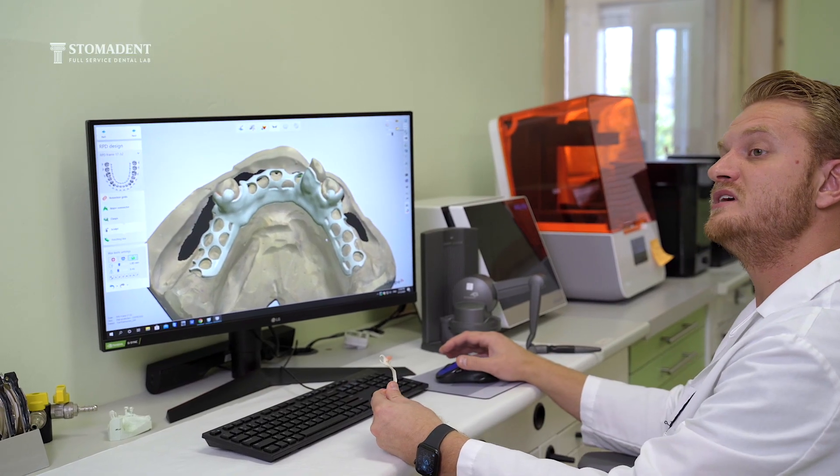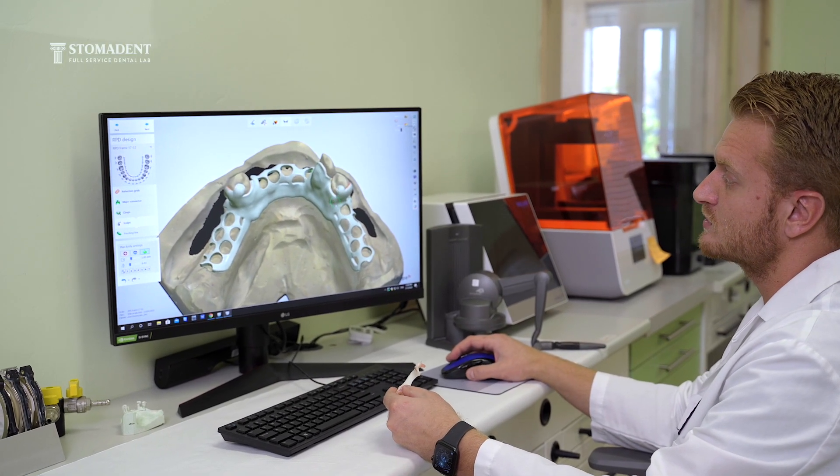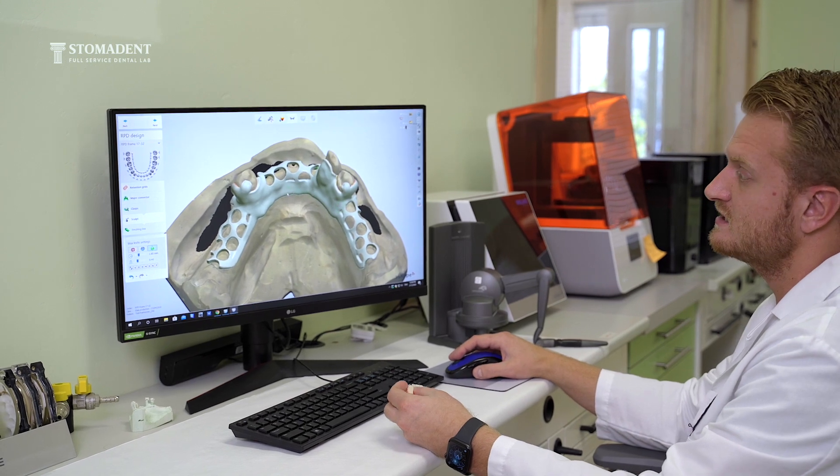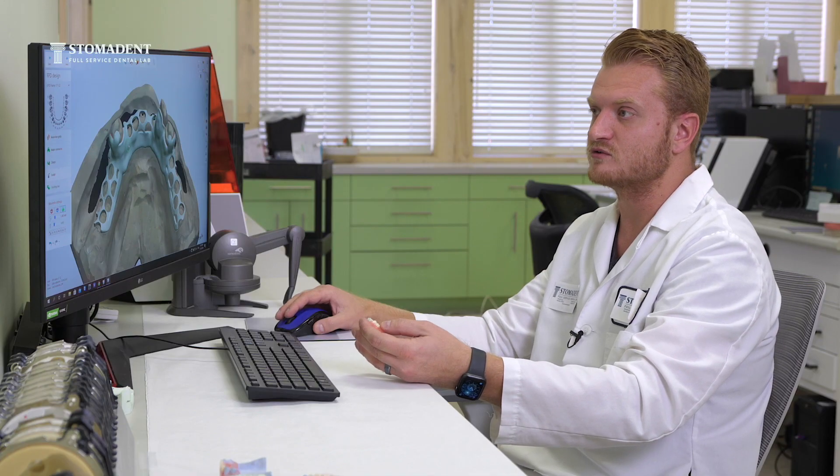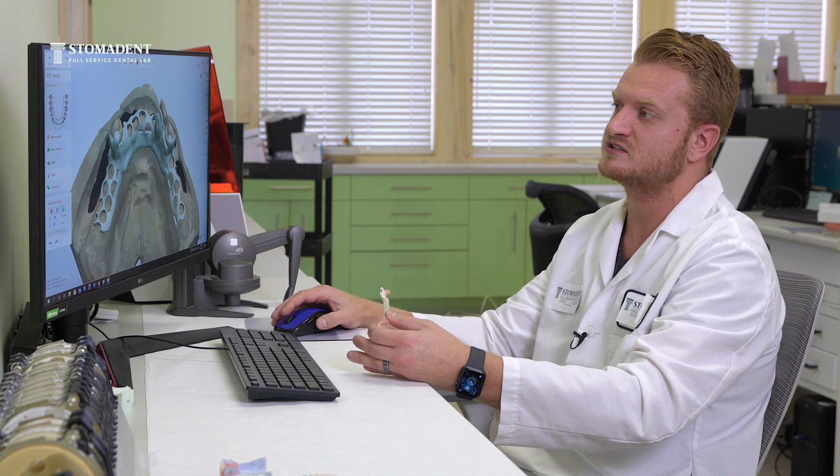The main difference between the metal frameworks such as wyronium or titanium is that these flexible acetal frameworks are tooth colored, so they will match the teeth of the patient and at the same time be flexible in the patient's mouth.